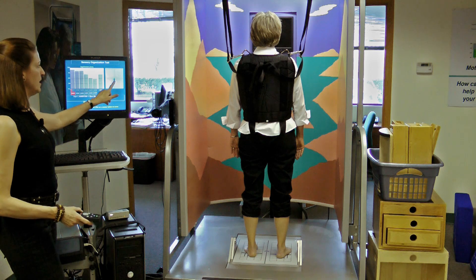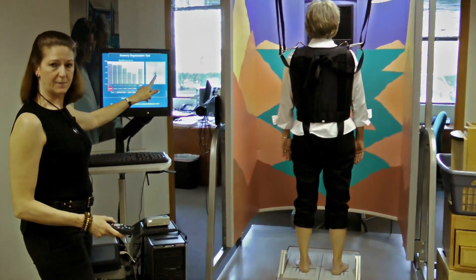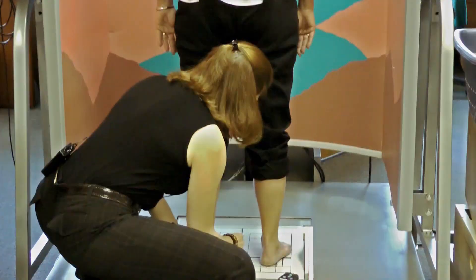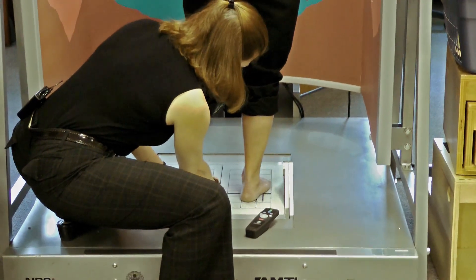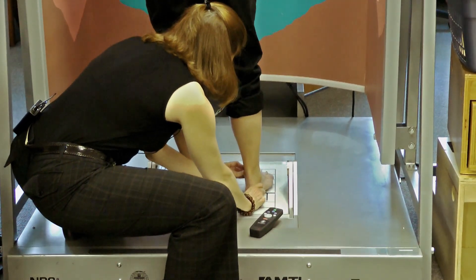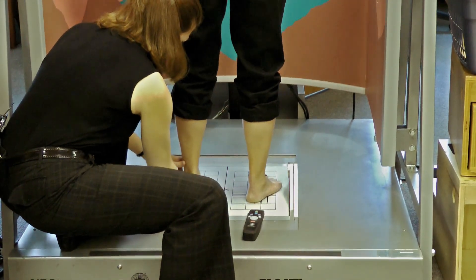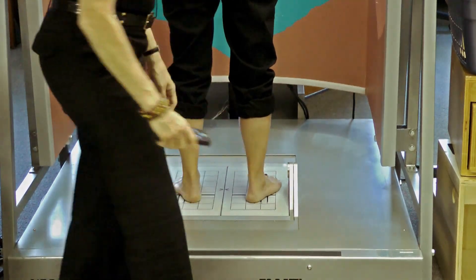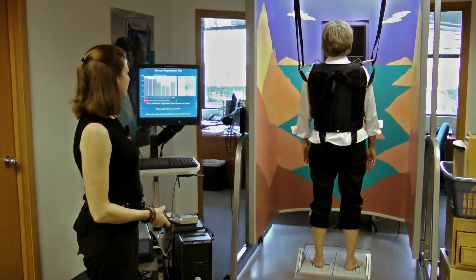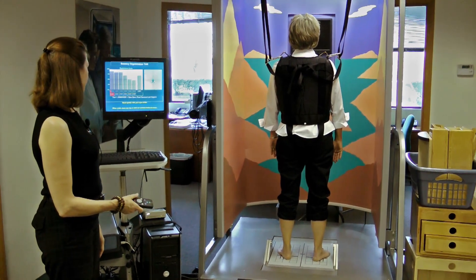I've got her set back and I'm going to check her feet because the center of gravity alignment is slightly off. I'll come back and check her feet. She can splay her feet a little bit for comfort. Stand straight, arms relaxed.